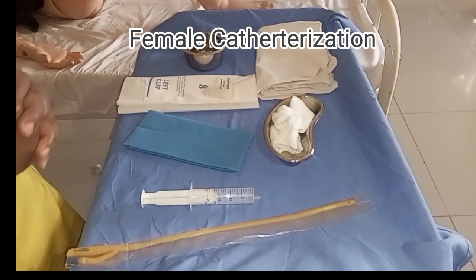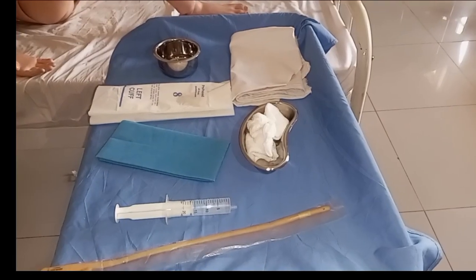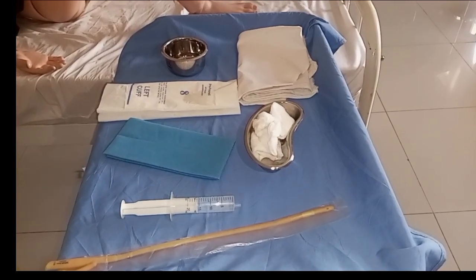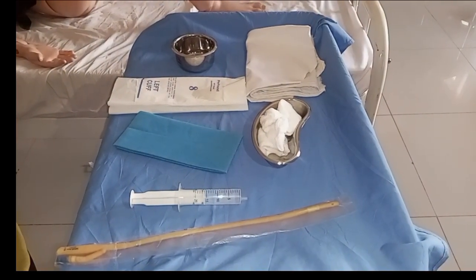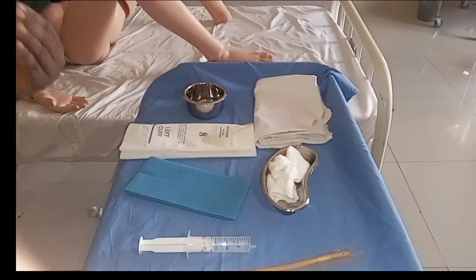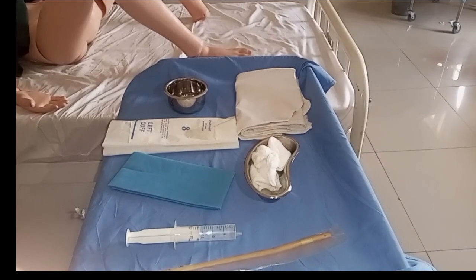Nurses and future nurses, welcome back to my YouTube channel. On today's episode, we are going to teach you how to catheterize a female patient. Remember, before you carry out the procedure, you have to introduce yourself. During an OSCE examination, you just have to introduce yourself and let the patient know who is taking care of them. Introduce yourself, explain the procedure, and obtain informed consent.